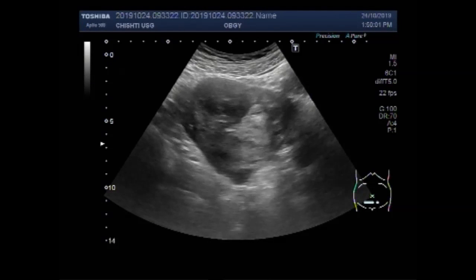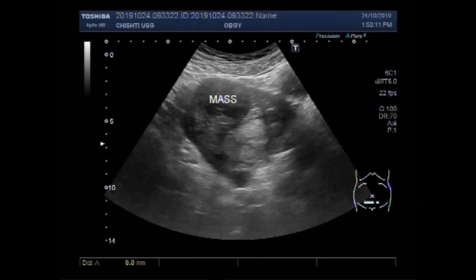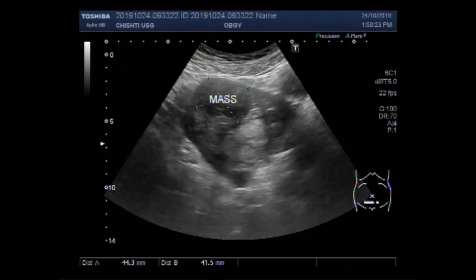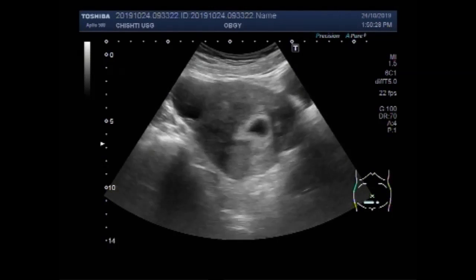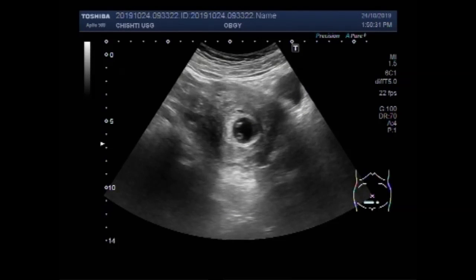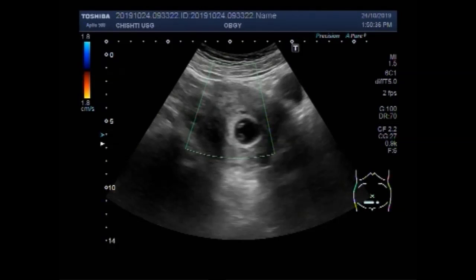The cyst measures about 35.5 mm x 34.4 mm. Now the uterine mass is visible attached to the distal portion of the uterus near the anterior wall. This mass measures about 44.3 mm x 41.5 mm. The mass is round to ovoid in shape and semi-solid to solid in consistency, with homogeneous echogenicity — it looks like a fibroid.